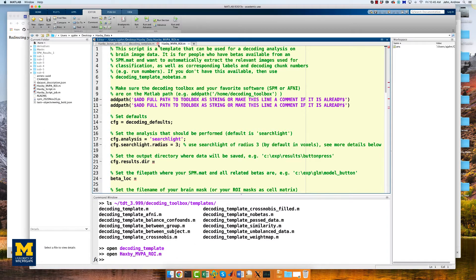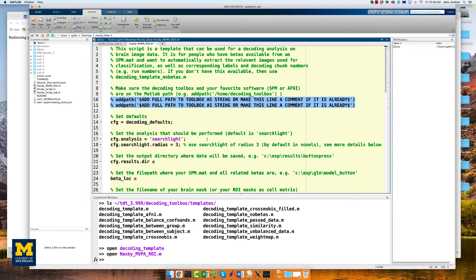You will see several fields that need to be either filled in or commented out. The first couple of Add Path commands can be used to set the path to the Decoding Toolbox and SPM if you need to. Since we've already set those paths, we can comment out these lines.